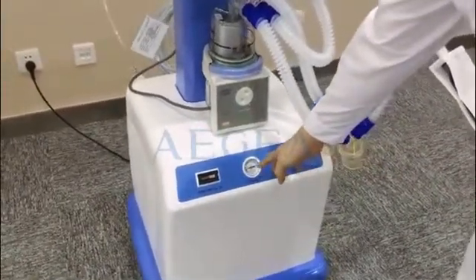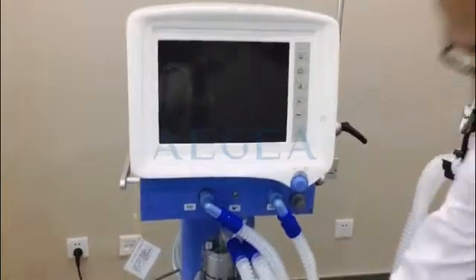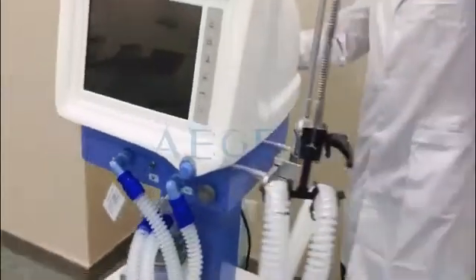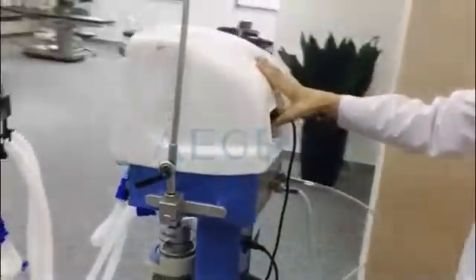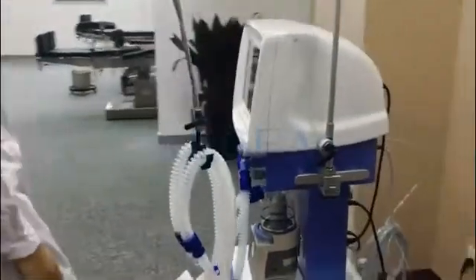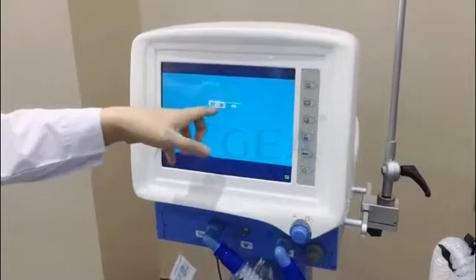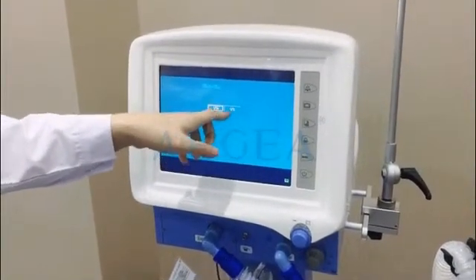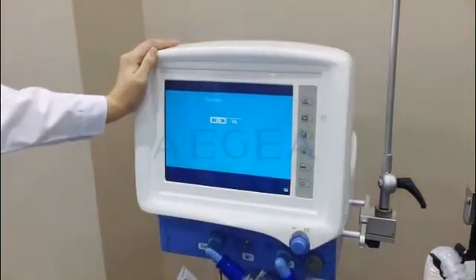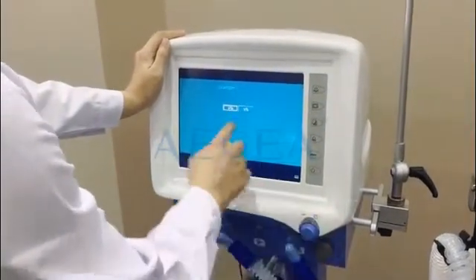When the pointer goes in the green area, we can turn on the main unit — the monitor. Let's turn on the button. Now you can see the standby interface, which has two choices: VTH and VTL. The first mode is for the adult and the latter one is for the child. So we can choose as per the actual situation of patients. Let's go with the first one.